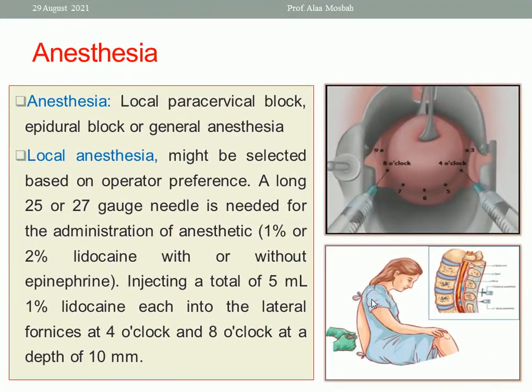What about anesthesia? I have either local paracervical block, as in this picture, or epidural block, as here, or general anesthesia. Okay. What about paracervical block? Look at this picture, please.